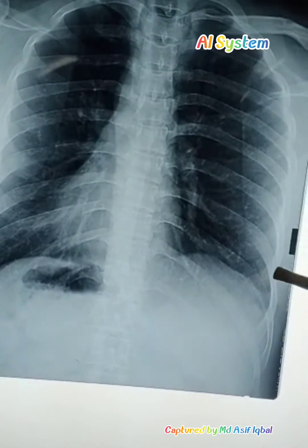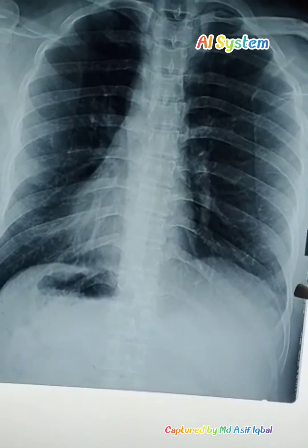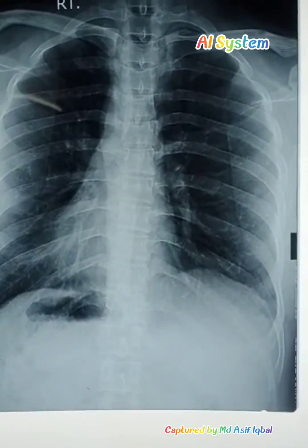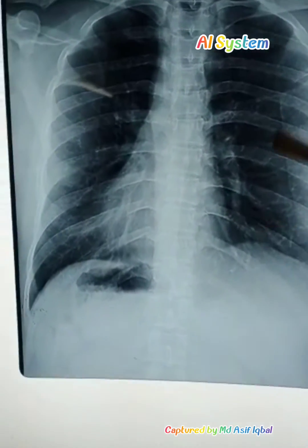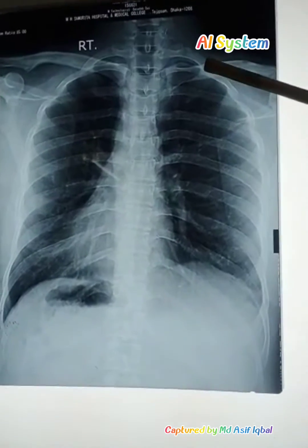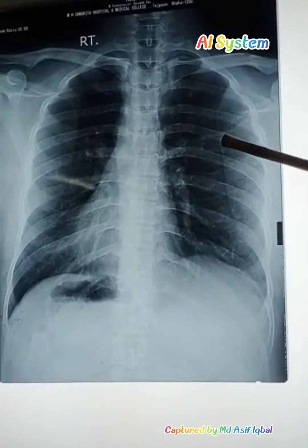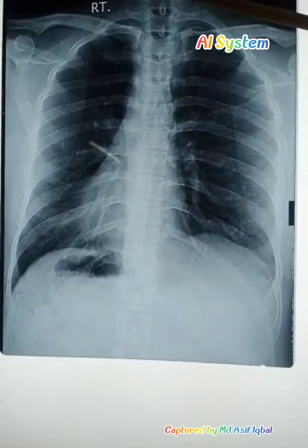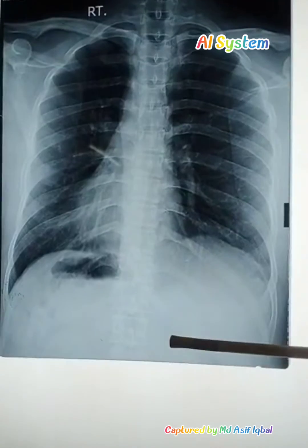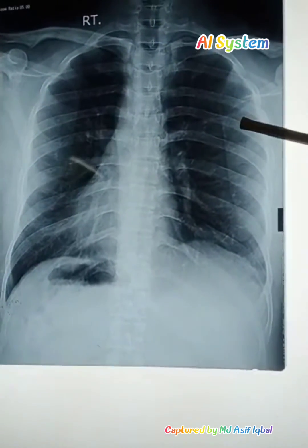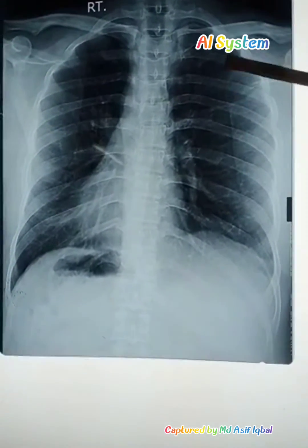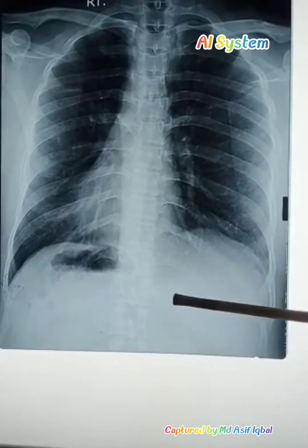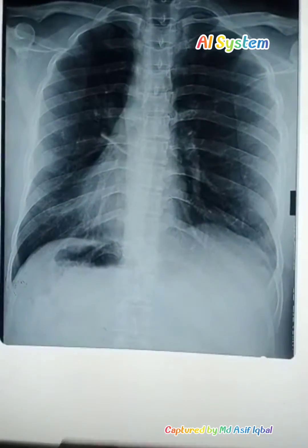Why does the lung shadow appear black while the heart and soft tissue shadows appear white? Because the lungs are radiolucent — radiolucent means black — and the heart tissue is radio-opaque — radio-opaque means white.